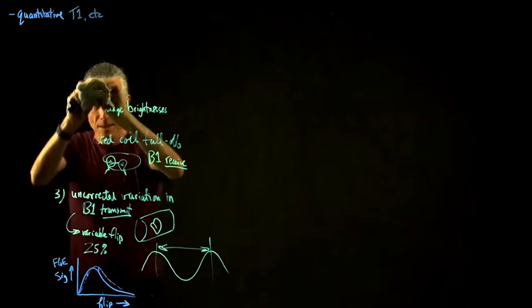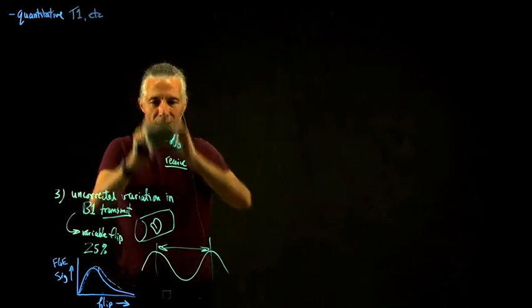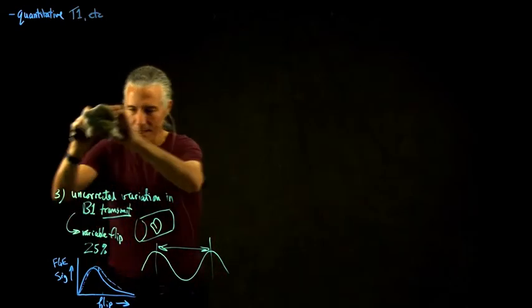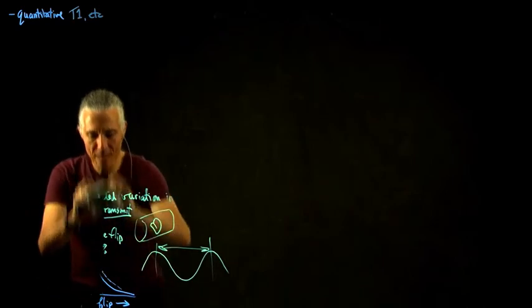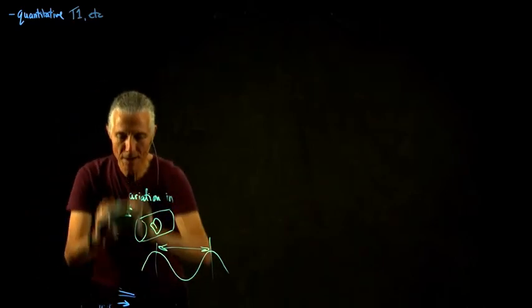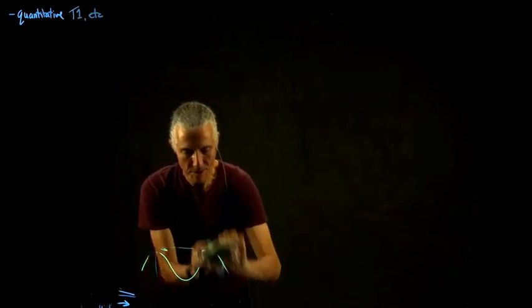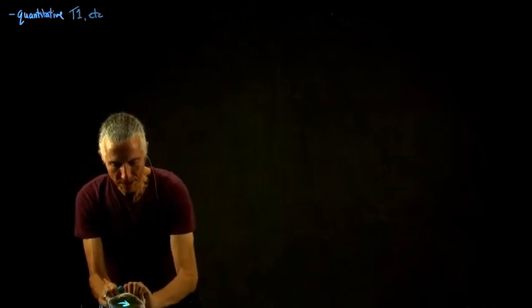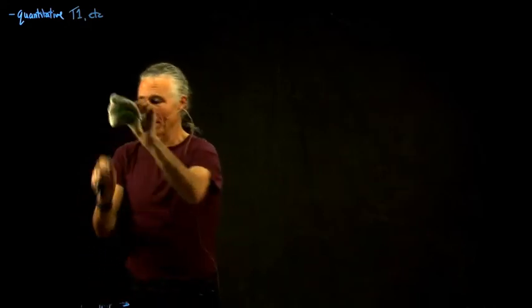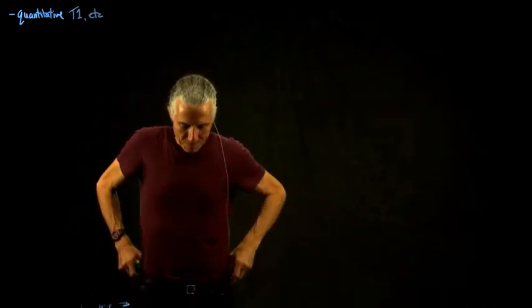So if we just have an image that has all these various distortions in it, we can try to fix it afterwards, but there's not enough information in that one number, because if you do an image, you just end up with a single number. You end up with two numbers at each pixel, which is the complex value, but you usually throw away the phase, and so you just end up with one number, and that's clearly not enough.